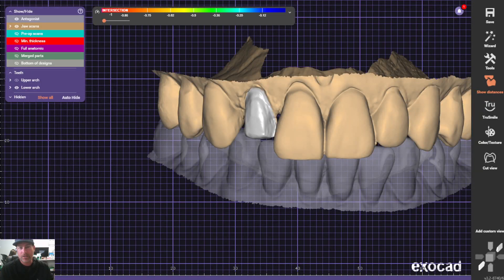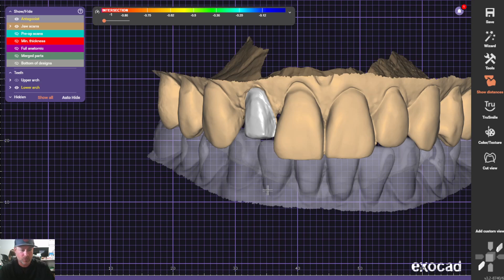Here's a quick video showing how to ditch the die for veneer cases. I'll show you quickly how I do this.